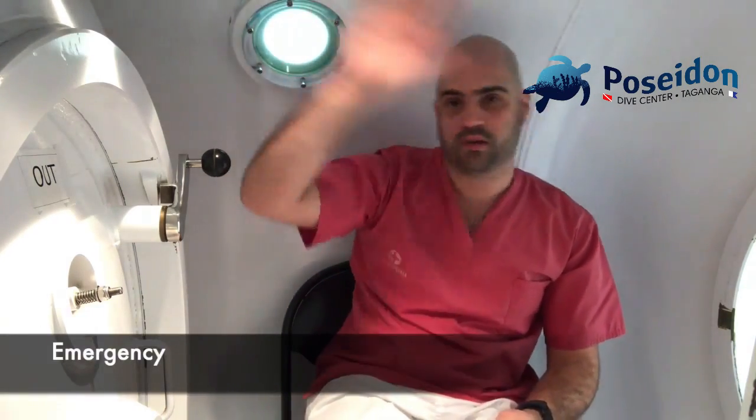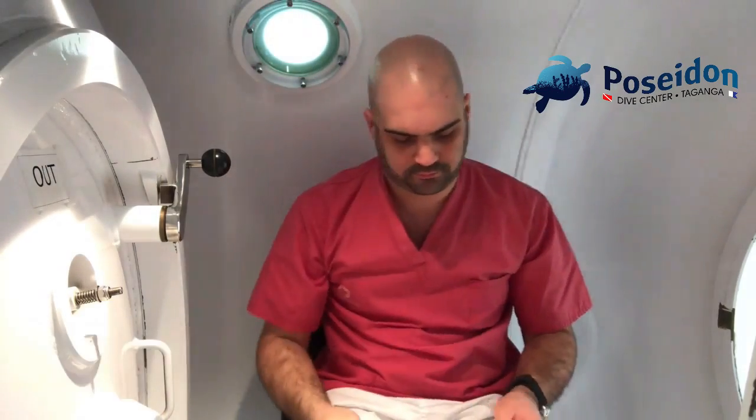If you have an emergency and you need the special attention of the operator or the tender, you have to shake your hand very quickly like this. Okay? This will mean stop. Stop any procedure, stop anything that you are doing and pay attention.